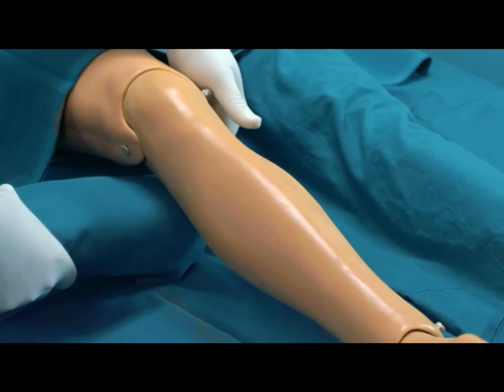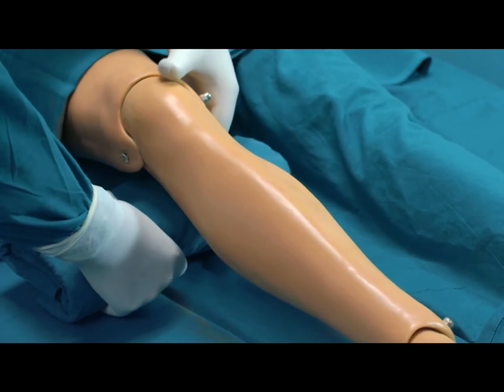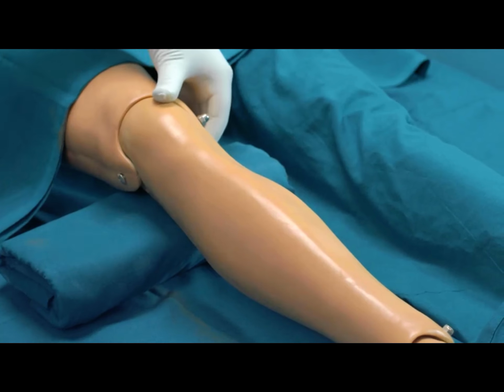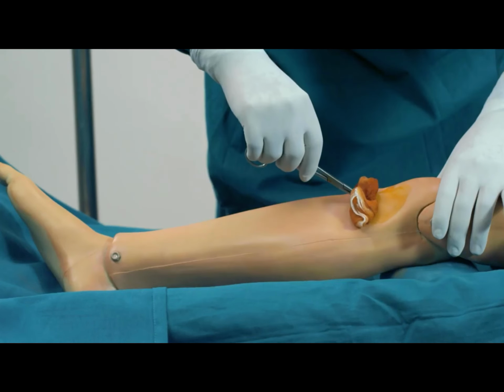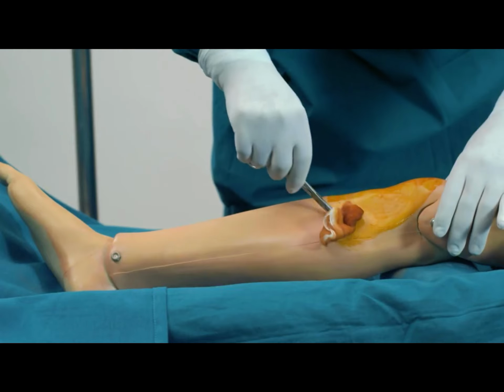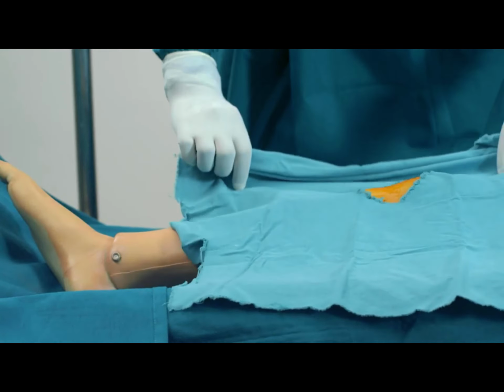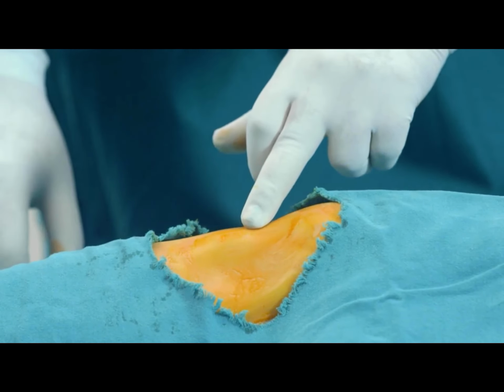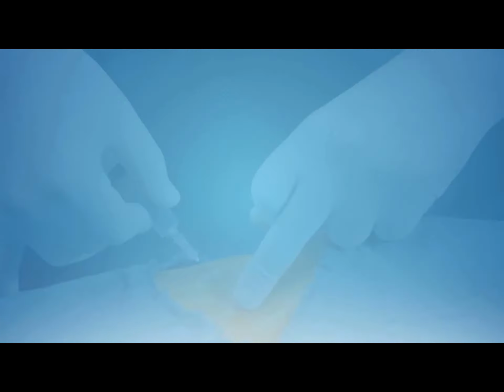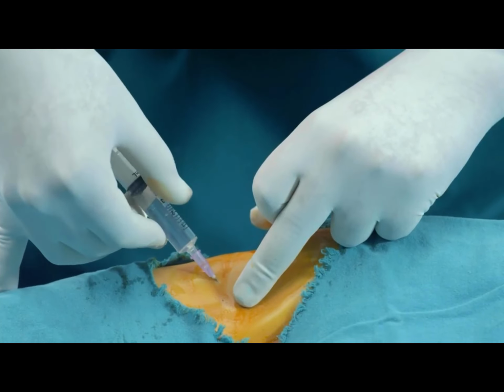The procedure starts with the positioning of the leg with a folded towel so there is slight flexion at the knee and external rotation at the level of the hip. Now sterilize the area with iodine solution and drape it. If the patient is conscious, then initially you will have to anesthetize the local area with 1% lidocaine.